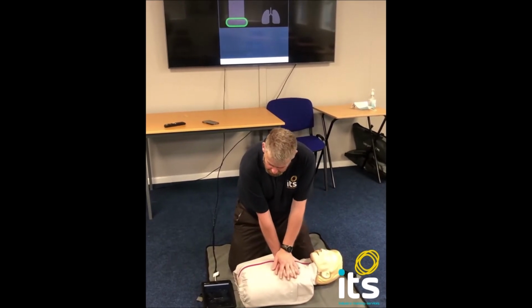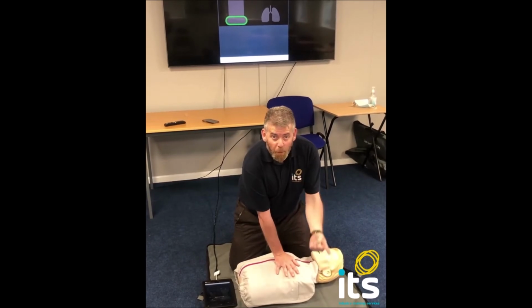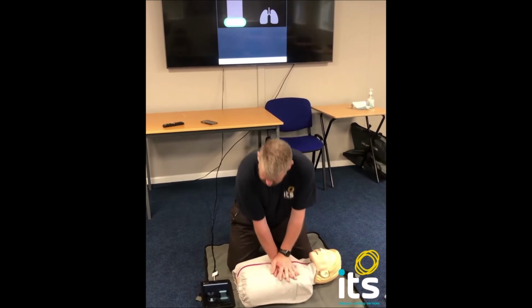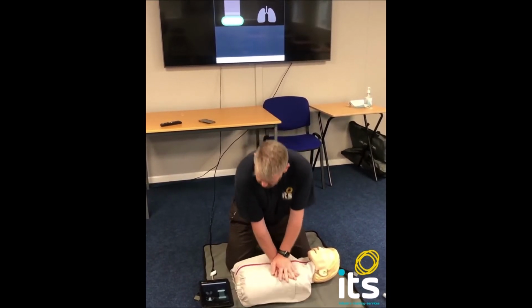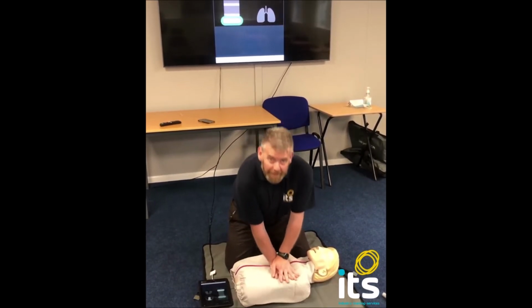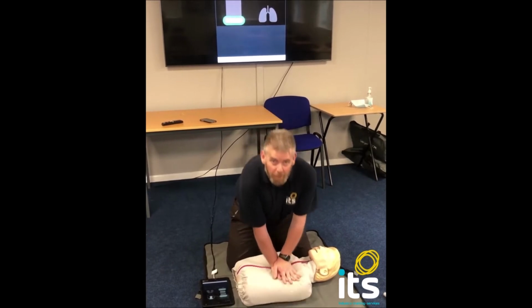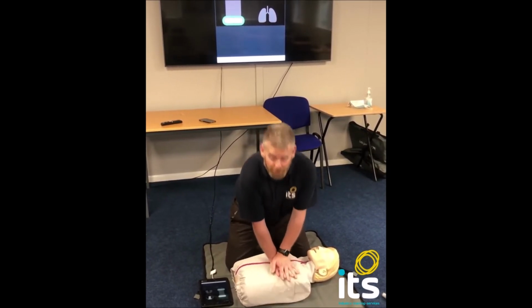What we're using here is the technology behind us, which will show you the height and the depth of each compression. The importance of this, folks, is that when you start, the heart is effectively stopped working as a pump, and all you're now doing is manually taking over from that pump. So every time you push down on the patient's chest, you're squeezing the heart, which moves all the blood out of the chambers into the body. Every time you come up, you're sucking blood back in. So it's effectively like a sponge. You're pushing out and you're sucking back in again.